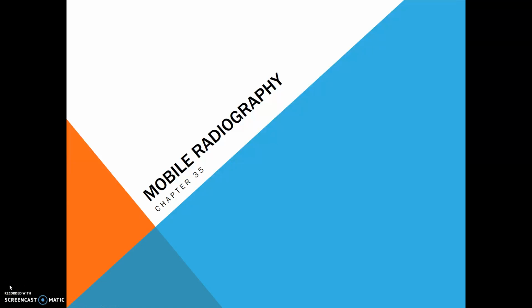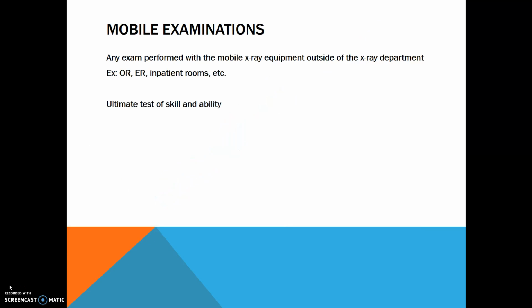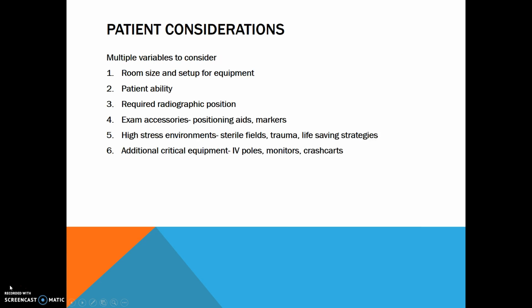This lecture will cover mobile radiography. Mobile examinations are any exams that are performed with the mobile equipment outside of the X-ray department, for example, in the operating room, emergency room, or inpatient rooms. They are an ultimate test of the skill and ability of the student or radiographer.